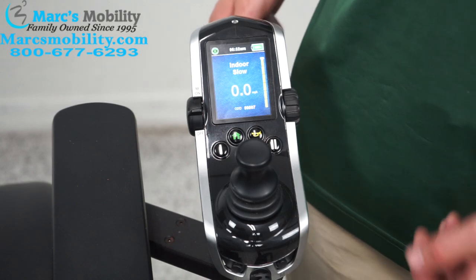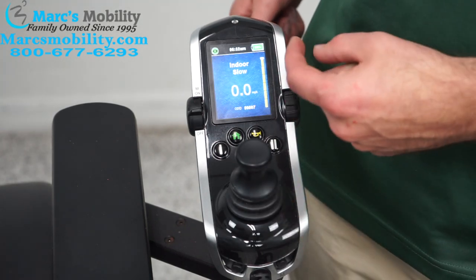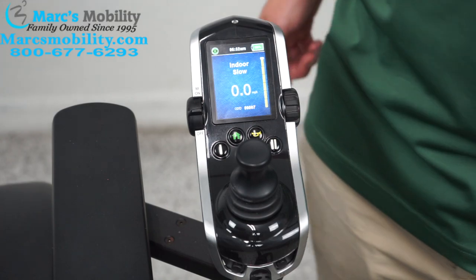In order to drive the chair, you push the joystick forward to go forward, back to go back, right to go right, and left to go left.